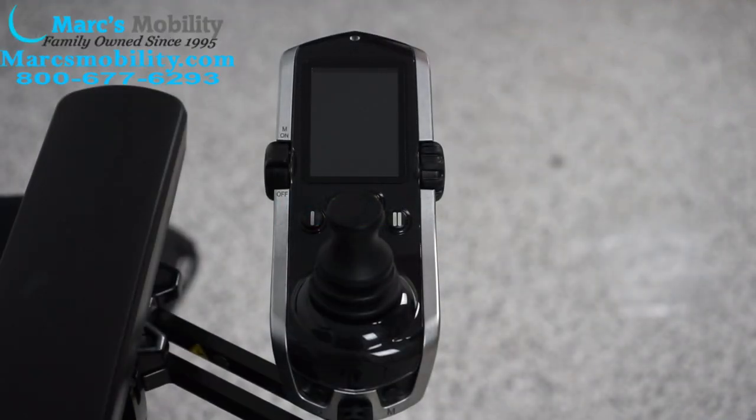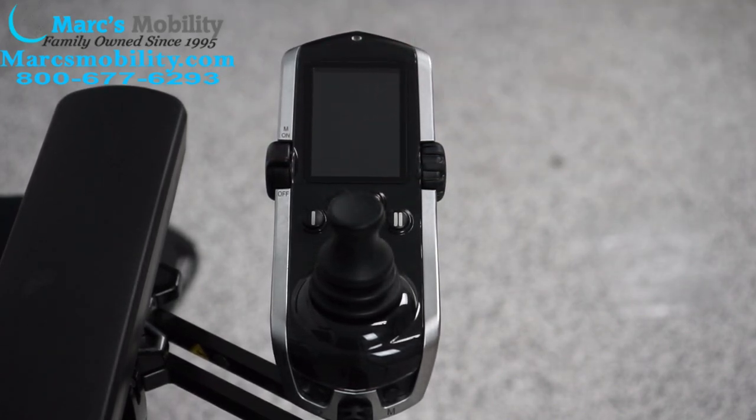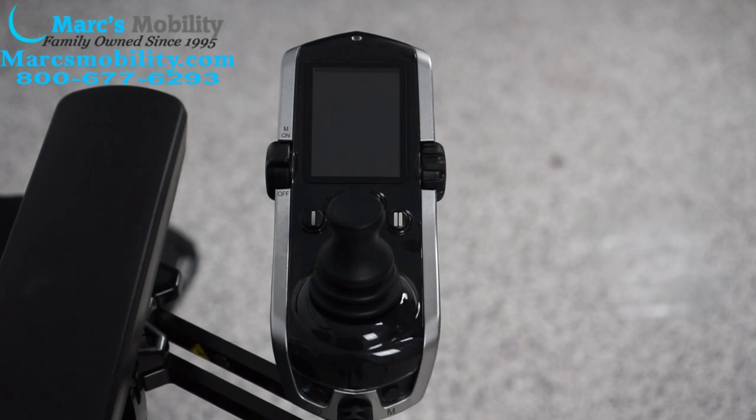In this demonstration we're going to show you the Quantum Q-Logic 3 and how to operate the basic functions on this joystick. Not all chairs are going to have the same functions, so I'm going to go over everything. This one has all four functions, but not every chair has those functions.